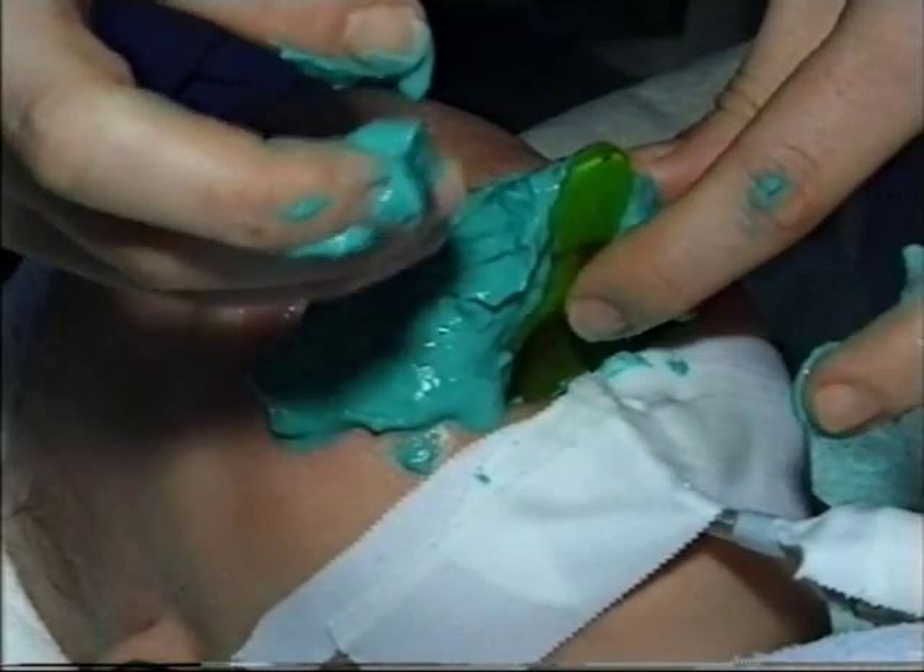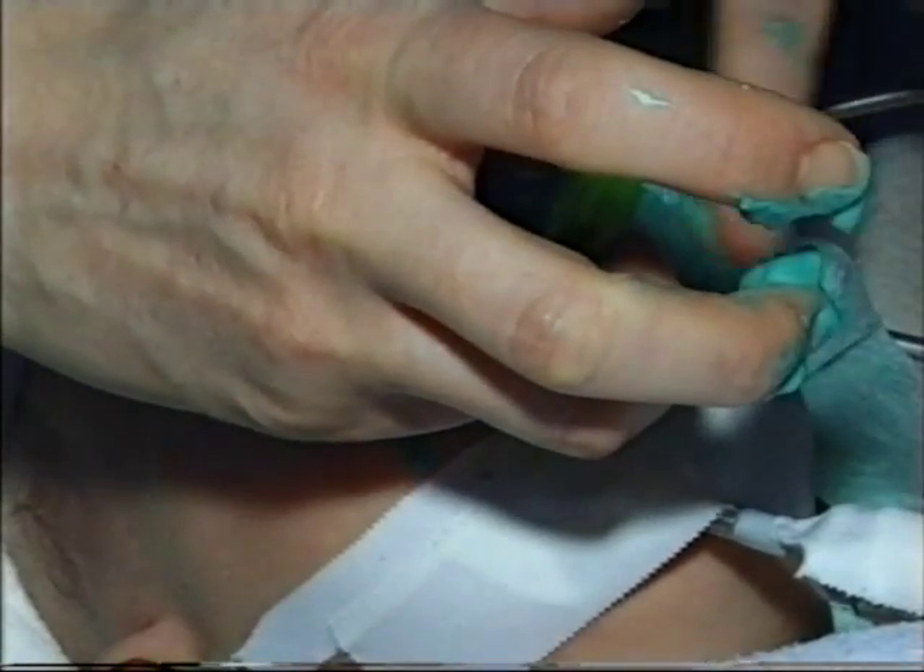Now we are putting the upper tray with impression material and then we are going to cover the face with the impression material.